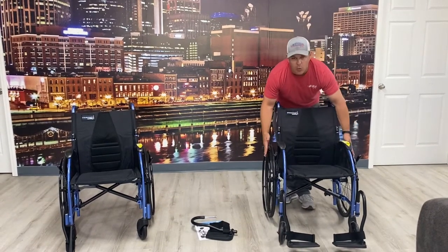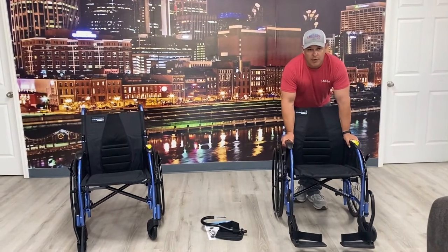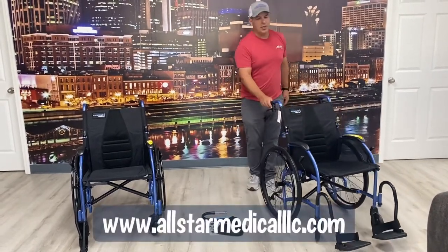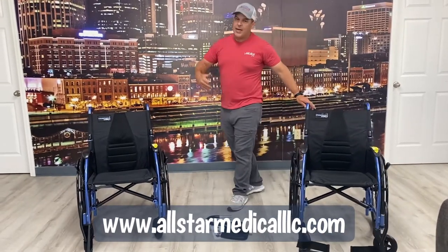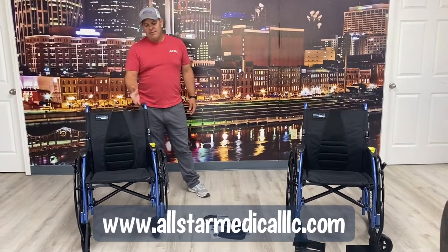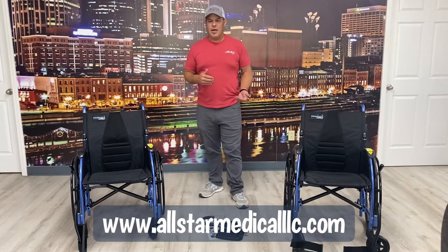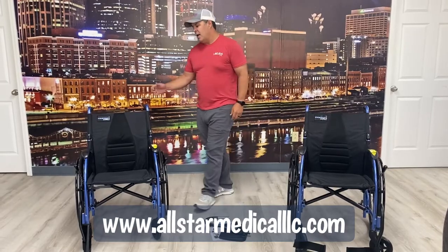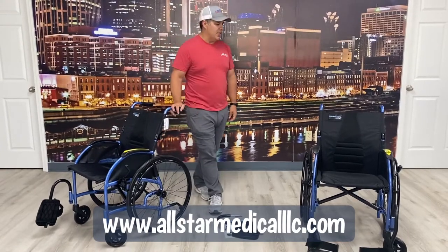This has a 300-pound weight capacity. They are 18 and 20 inches wide — that is the seat width. The overall width is 27 inches, so narrow enough to go through most door frames. You have 24-inch wheels on the backside. It's just a really good chair — so much different than a basic transport chair. Even if you don't take the wheels off and the leg rest off, you're still about 13 pounds lighter by going with an option like this. The ergonomic design on the backside just can't be beat.